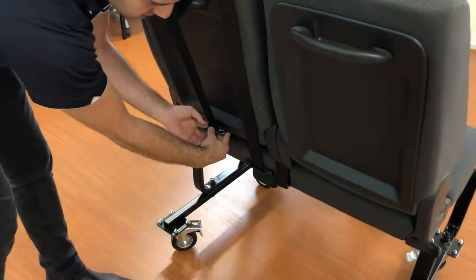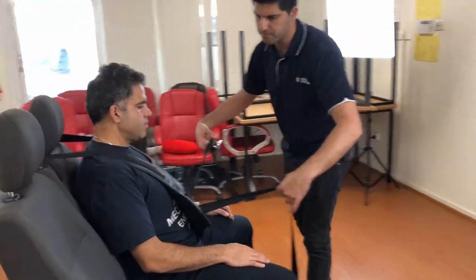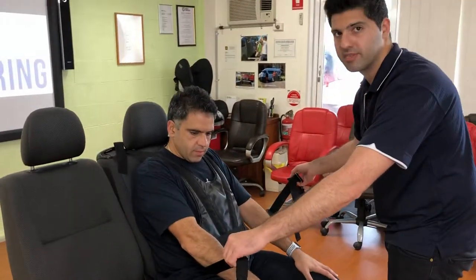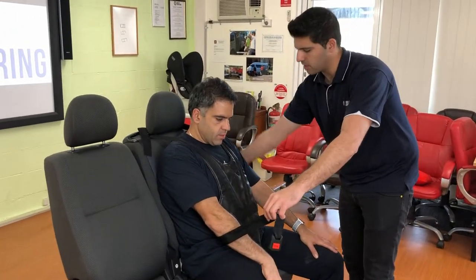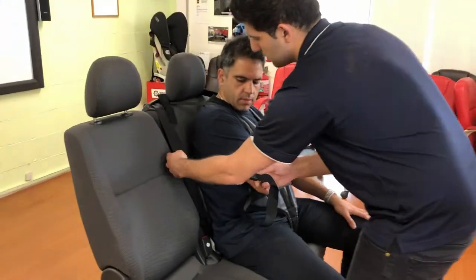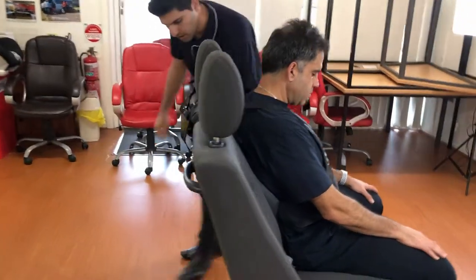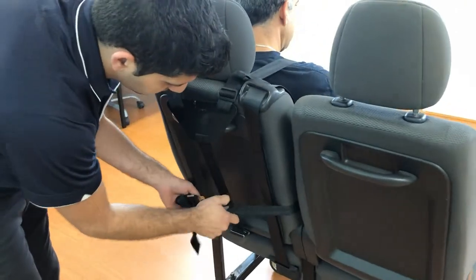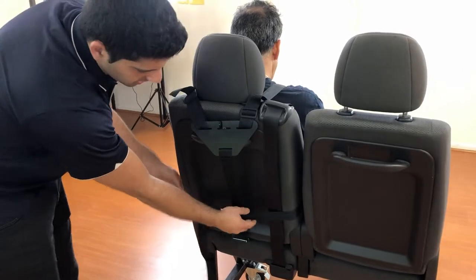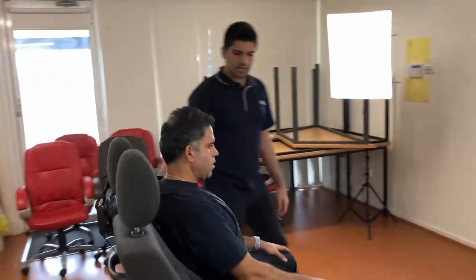From the front of the harness we've got the two straps that go around the occupant. It's also important to have the seat belt clear. On one side there's nothing, so we can feed the strap around easily. On the other side we have the seat belt, so we slightly pull the seat belt out, feed the strap through, then come from behind and attach the two clicks on the side.